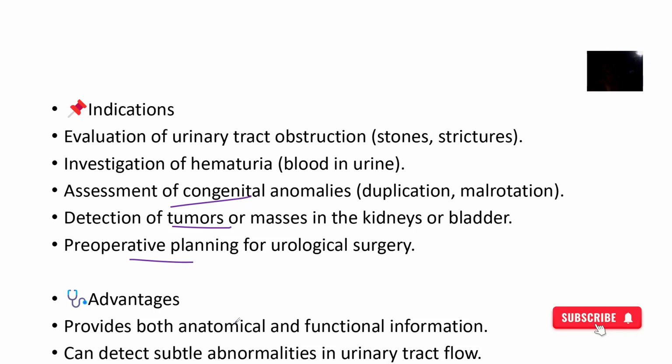So advantages, it will give you a lot of information and help you to detect anything that is abnormal within the urinary tract of a human being.